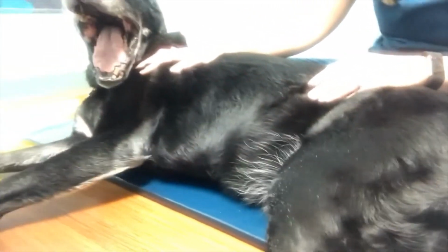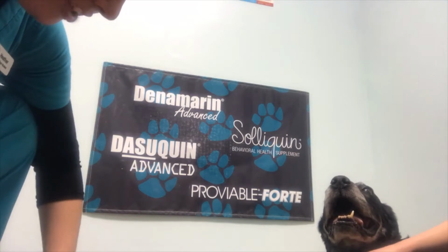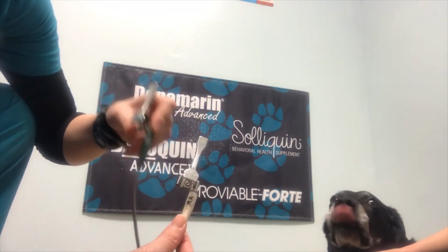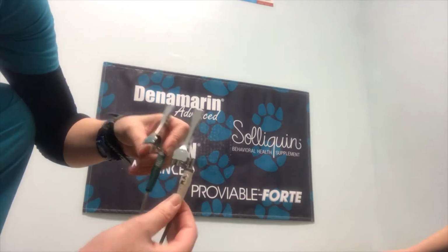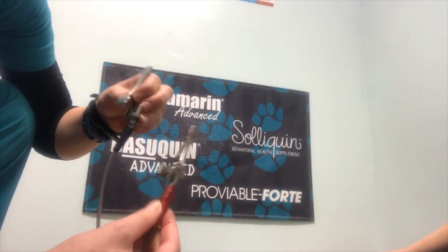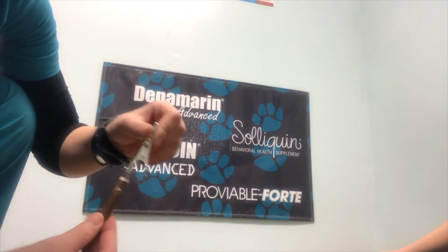When we place our leads, I have them laid out here. They're all color-coded for which leg it goes on. I always remember that white goes on right, and snow over grass, and that will be on the right arm and the right leg. And we also have smoke over fire, and those go on the left leg and left arm. And our brown one here is for the ventral or for the chest area.